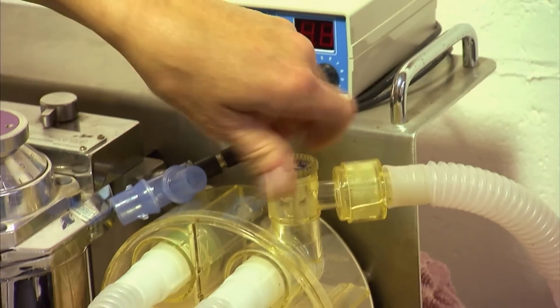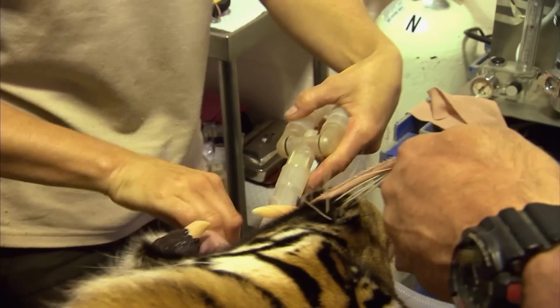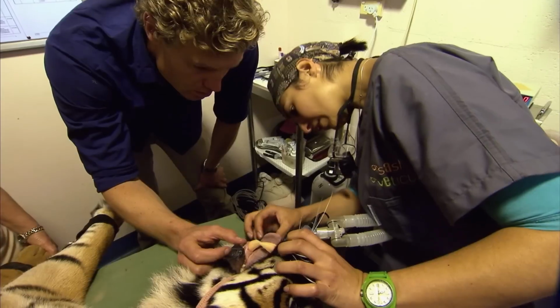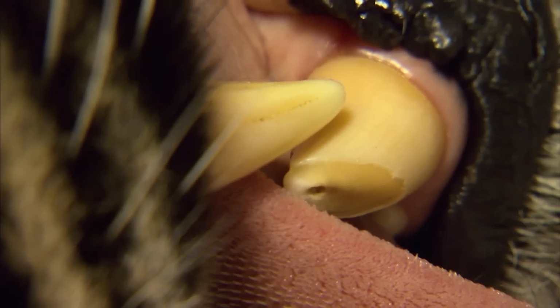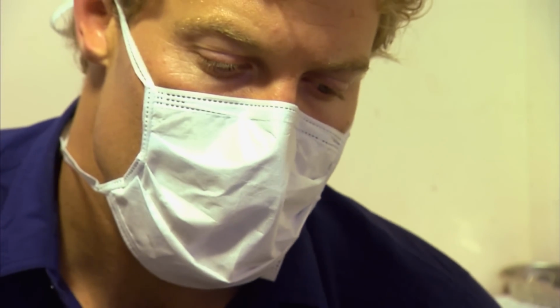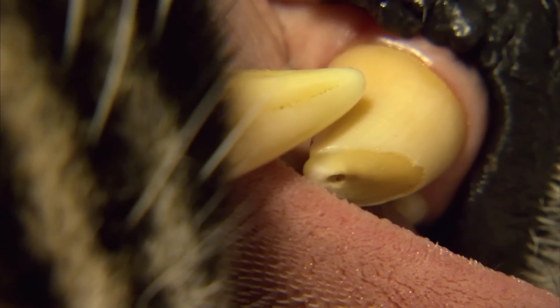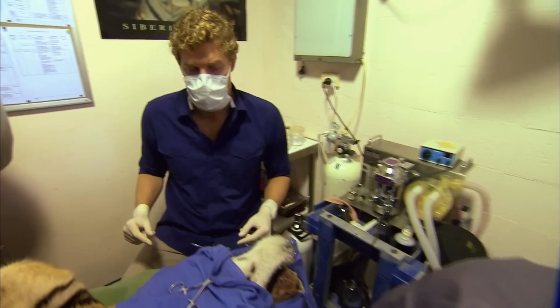With Soraya now sedated and restrained, the extent of the Sumatran tiger's tooth fracture is finally revealed. So she's got crown fracture, so that's very, very painful, very sore. Chris has invited Sash dental surgeon Nadine Fiani to perform the delicate operation. Her canal is a spectacular 7 centimetres. That's huge. There's 7 centimetres of tooth beneath that fracture. Just below the fracture, yeah. Crazy stuff. Amazing.